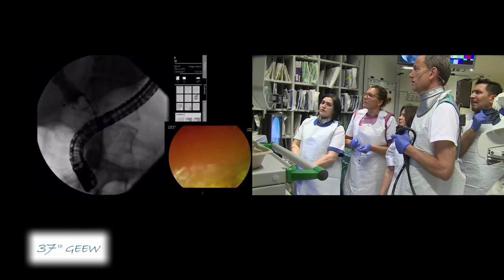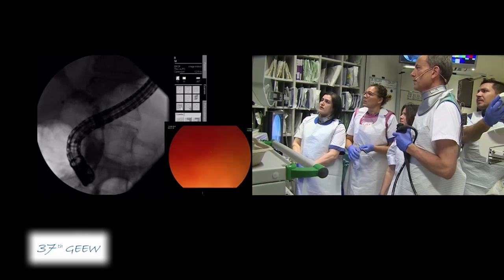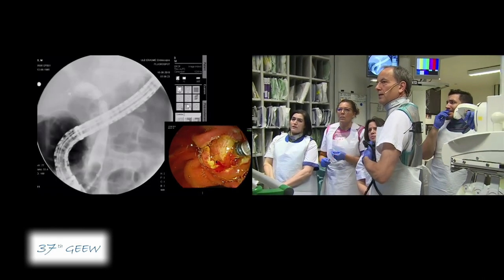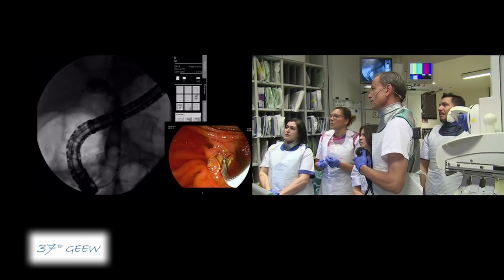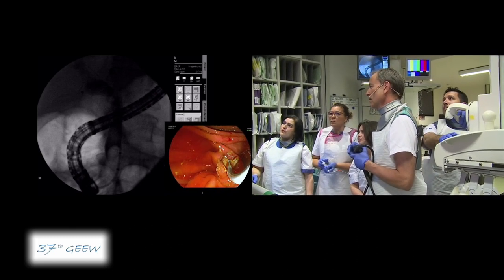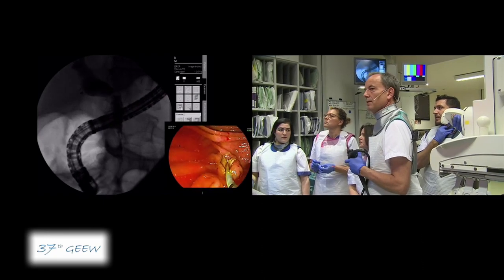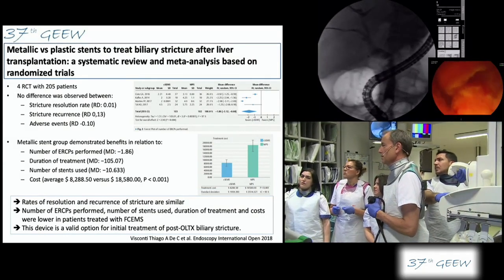It's dilated on both sides. I can easily pull the balloon through. The balloon size is up to 15mm, and it can be gradually expanded to 15. It's a very short stricture — you can see it now, just about two centimeters. A fully covered metal stent would be an option, but it was discussed with the patient that he will receive plastic stents — two plastic stents. We deflate the balloon and keep the wire in place. There is no more debris visible inside.